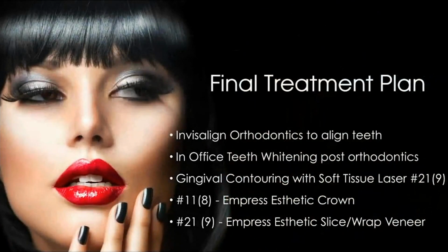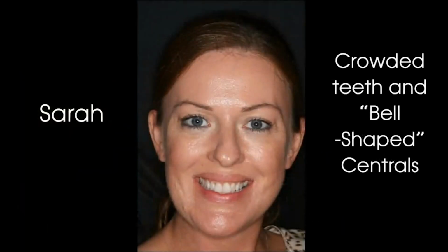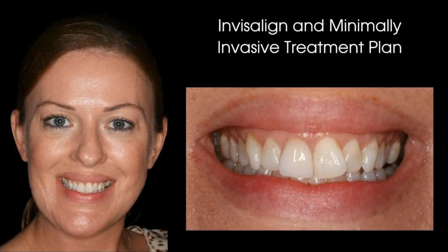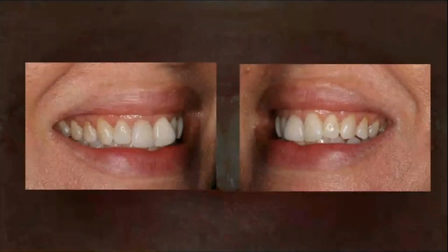My final treatment plan was Invisalign to align the teeth, in-office whitening, gingival recontouring, number 8 an Empress Aesthetic crown, number 9 a wrap veneer. So here she is, Sarah, with the crowded, bell-shaped teeth. And number 8 is the existing crown. So this is her treatment plan, all right?